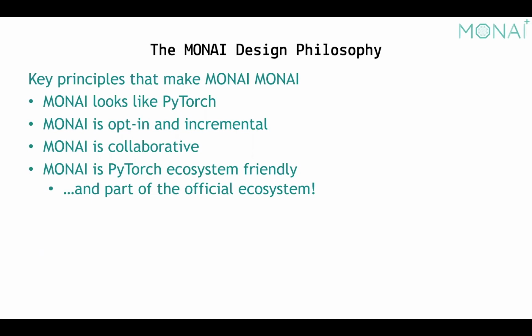And so we adopted PyTorch as our underlying library, but we also adopted the PyTorch design and the PyTorch design philosophy, which is why MONAI, as you have seen and as you'll continue to see, looks an awful lot like PyTorch. And these are our key principles that we've really focused on: that MONAI continues to look like PyTorch, that it's opt-in and incremental, that it's collaborative in terms of the overall ecosystem that exists around PyTorch. And it's actually becoming part of the official ecosystem of PyTorch, which is very exciting.